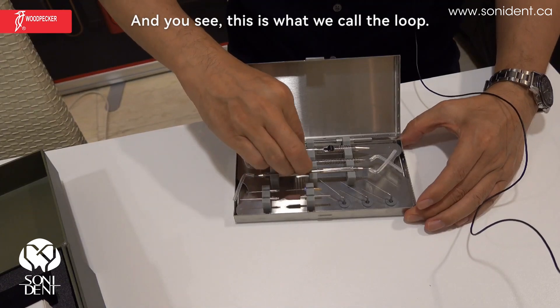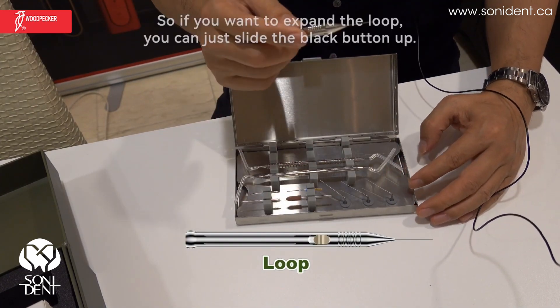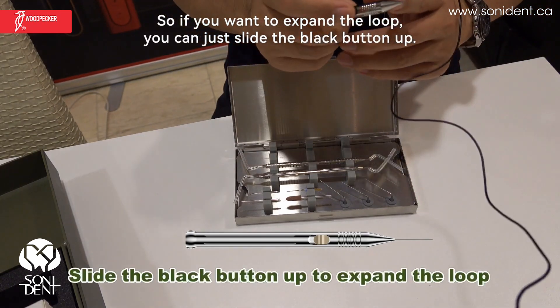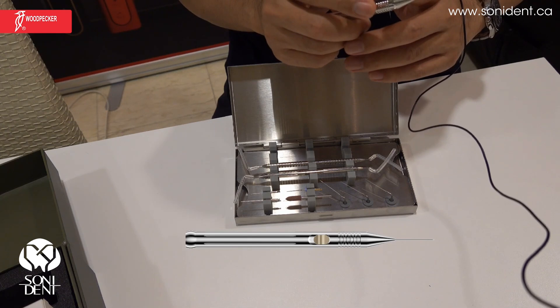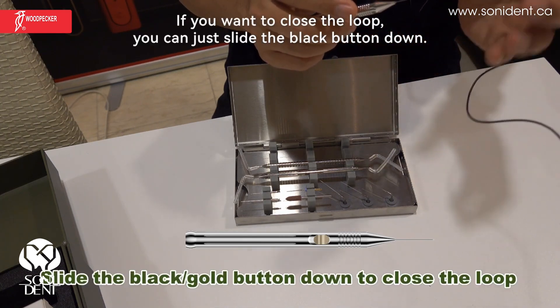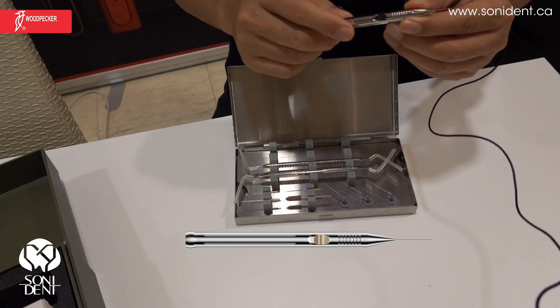This is what we call the loop. If you want to expand the loop, you can just slide the black button up. If you want to close the loop, you can just slide the black button down.